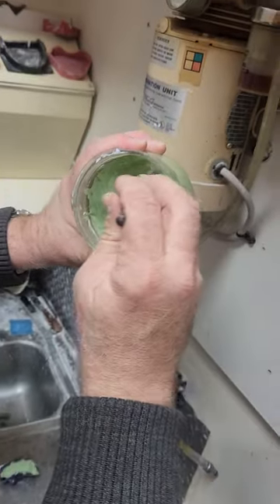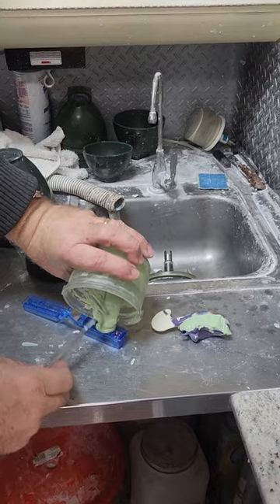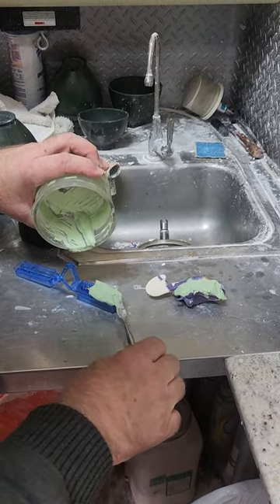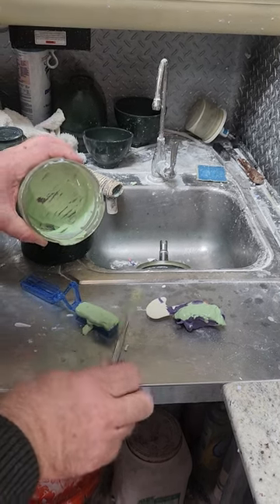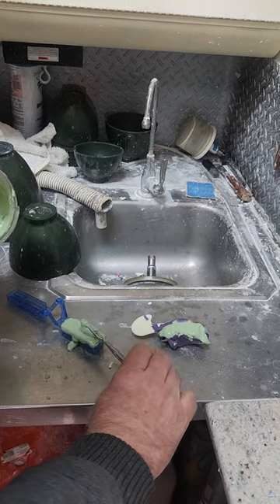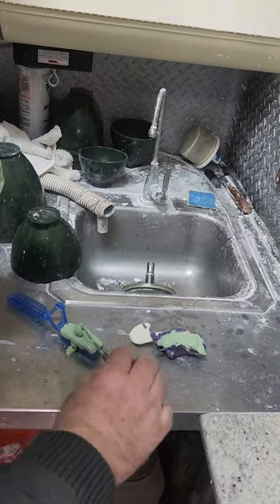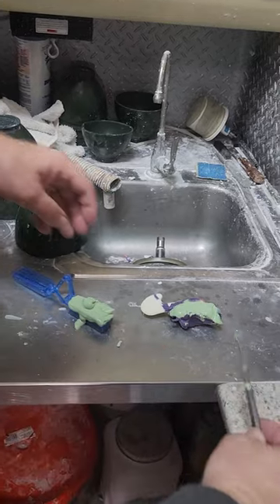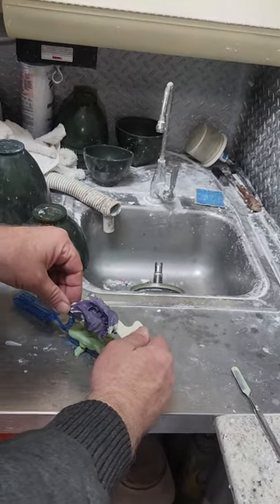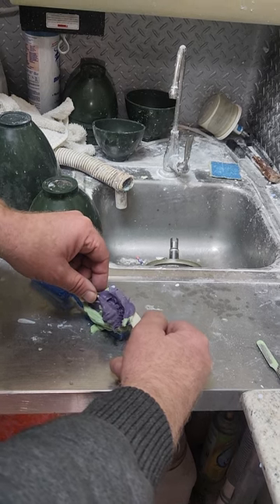Then we're going to put this right here like this. I want enough stone in here so that it fills all of the confines — get a little bit more. That's the side that has the pins in it. Next we'll take this and put it right over the top and let it just set.